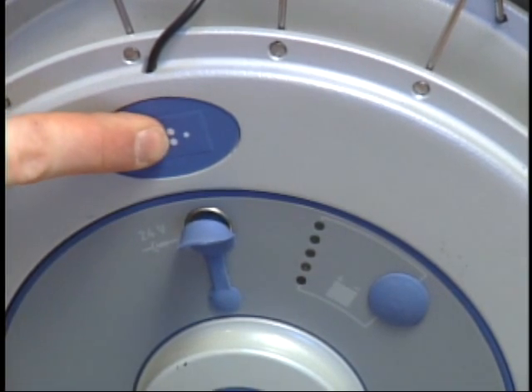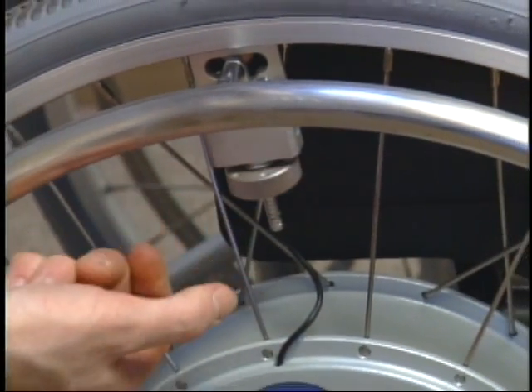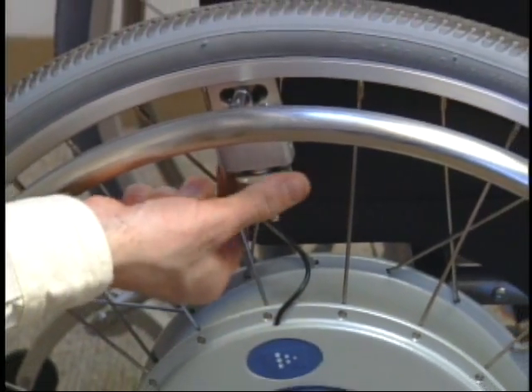An acoustic signal confirms the change. The sensitivity of each wheel can be independently changed by turning the adjustment screw.